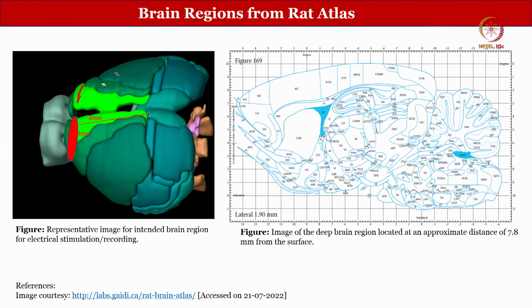To do that, in the video we first show the local anesthesia technique, and we use something called lignocaine for the local anesthesia. Then, in the same video, you will be able to observe how the craniotomy is done and how the motor cortex, SMA and somatosensory cortex are exposed. First you have to remove the hair, then clean with ethanol wipes, and of course anesthesia is given.